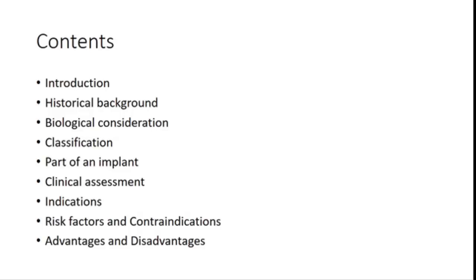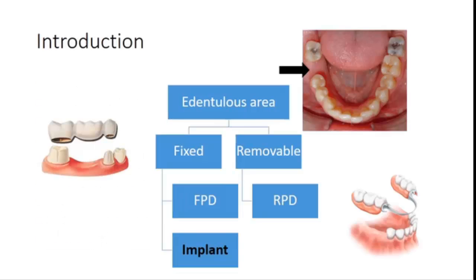Now, what do you understand by the term implant? An implant is one of the methods by which we can replace the missing tooth or teeth.